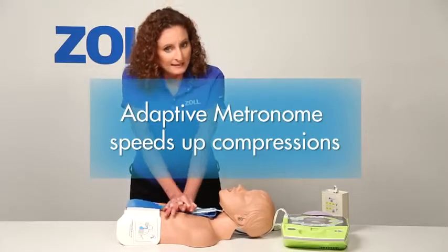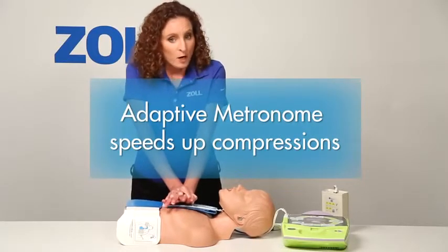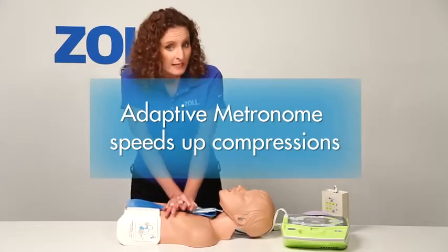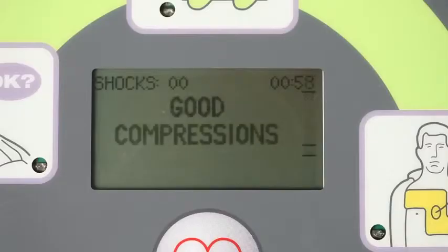The beeps act as an adaptive metronome that monitors my compressions and tries to speed them up to at least 100 per minute. Good compressions.